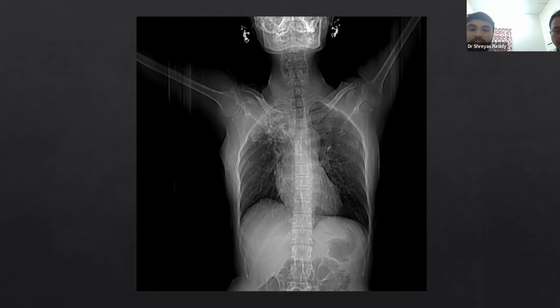For the first phase, it will be a pulmonary arterial phase. Second, will be an aortic phase. Yes. Third phase will be a delay. And the 4th one, we may take another delay to demonstrate active extravasation. So what is the first phase mainly meant for? Visualizing the pulmonary arteries, pulmonary circulation involvement in cases of tuberculosis. So next is the aortic phase where you see for any collaterals.